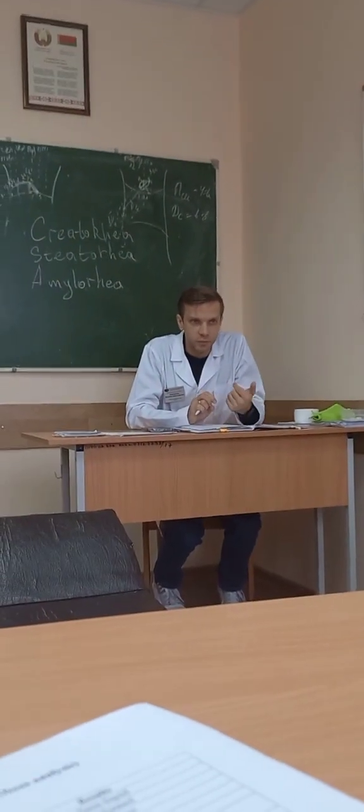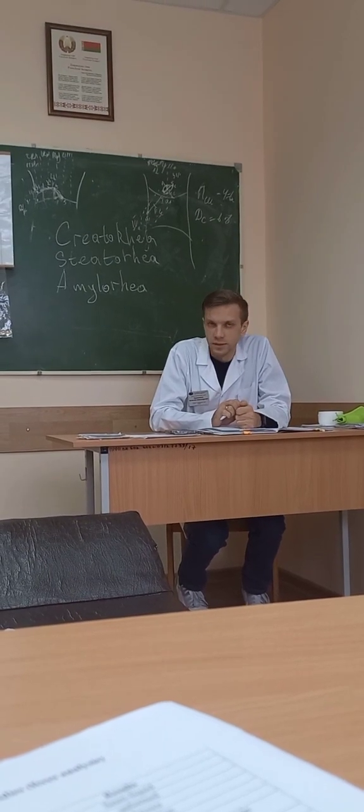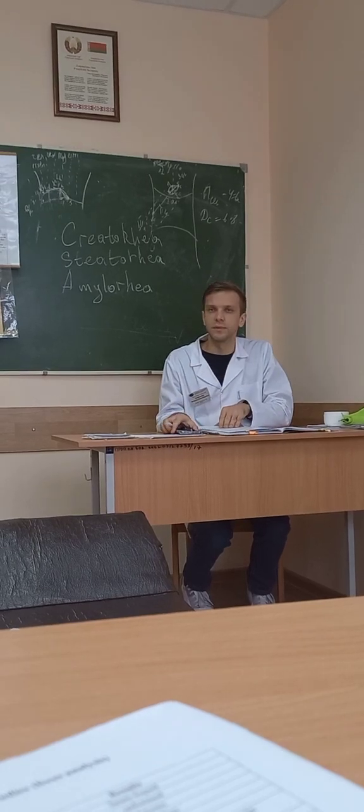Mucus in microscopy. Syndrome is putrid dyspepsia and disease is colitis. Okay. Let's read another card.